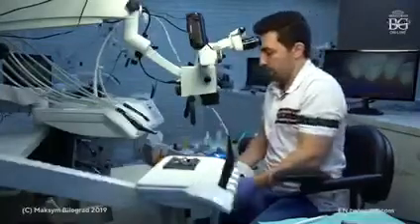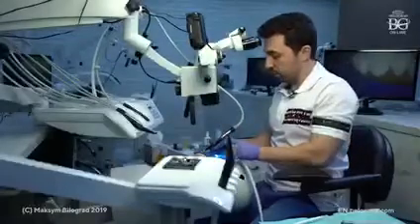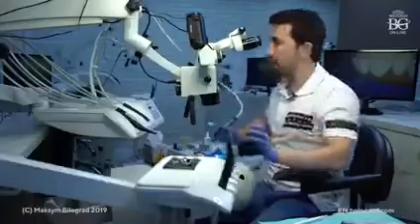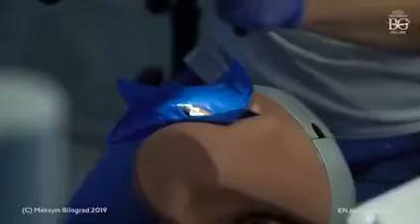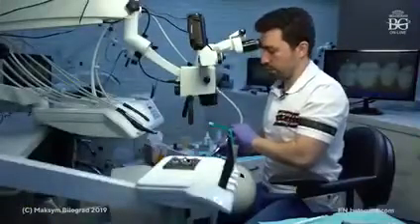So yeah, we decrease magnification just to see this group of teeth, and I will take my disc with just a little bit of water, really little bit of water. We don't need too much.